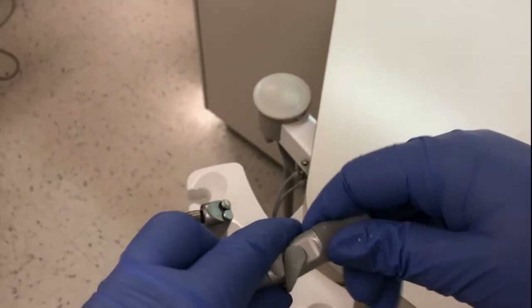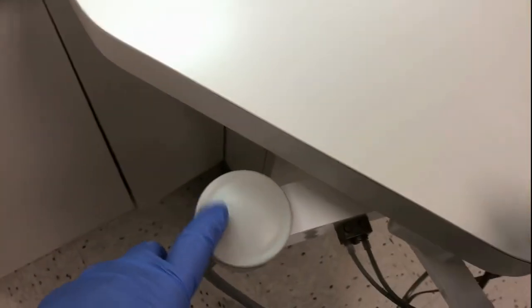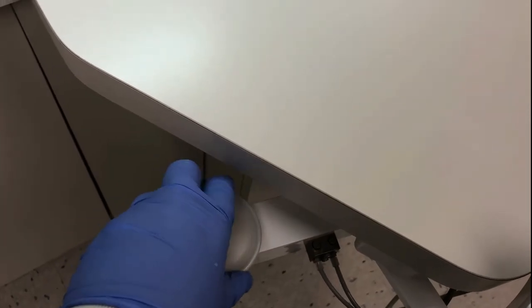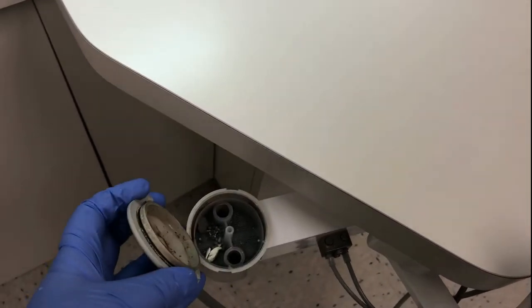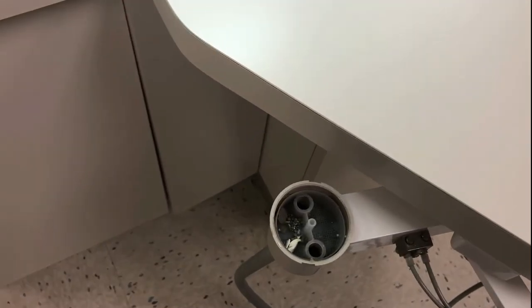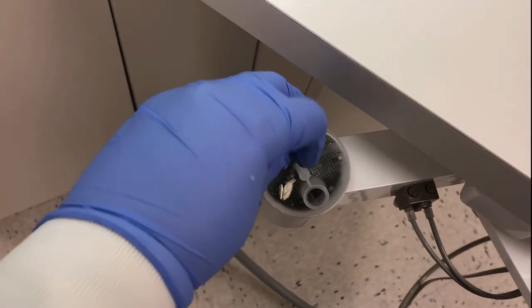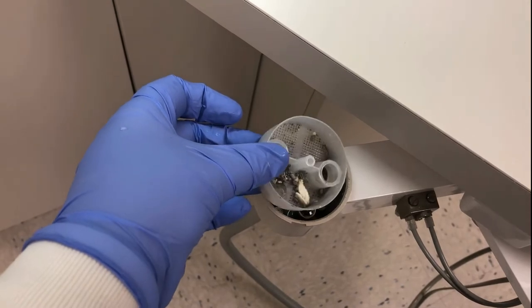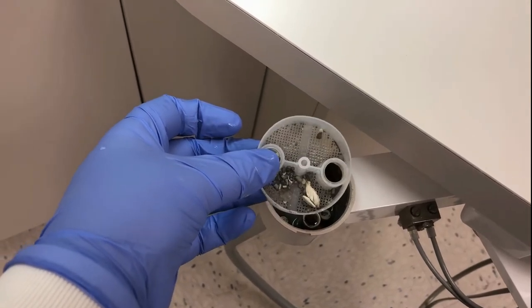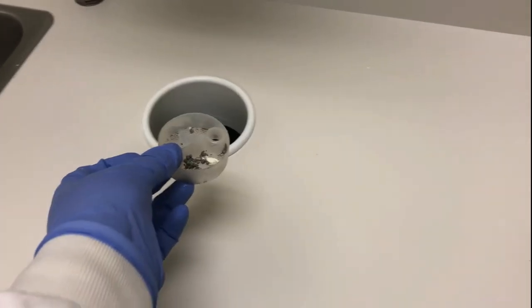Locate the HVE trap and remove the cover. If the trap is full of debris, dispose of the trap and replace it with a new one. Secure the new trap and place the lid on top.